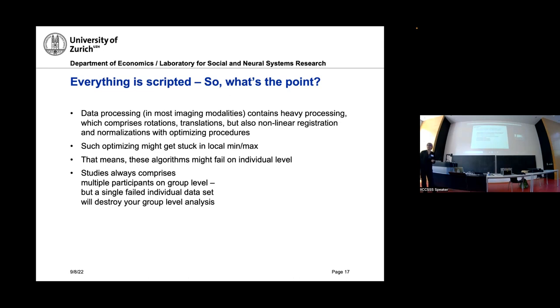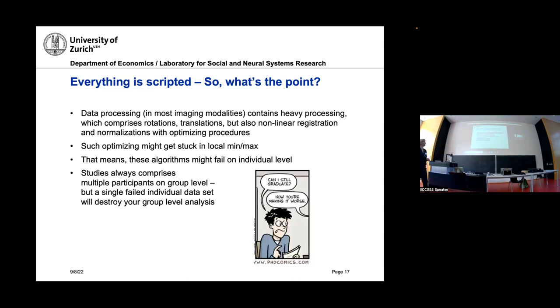And if you didn't check that, of course you can say, okay, if my results are fine, then everything is fine. But if not, you have to go back anyway, or from the very beginning you say, I look at whether everything is valid and I'm allowed to do the group level analysis. Otherwise you might end up like this guy and make it even worse. So first look at your data before you go to your PI.